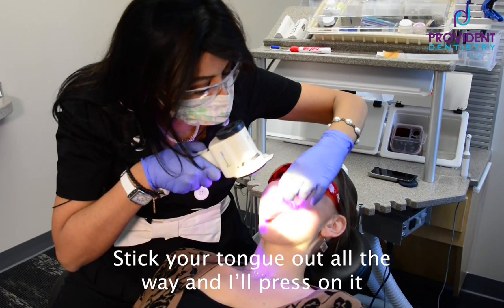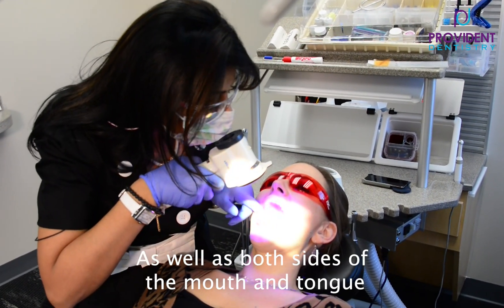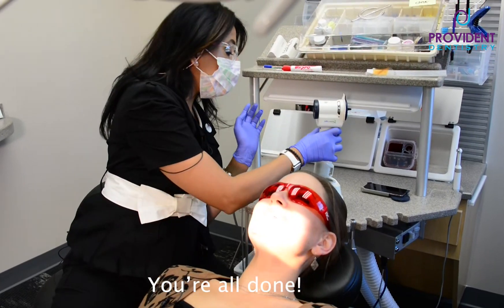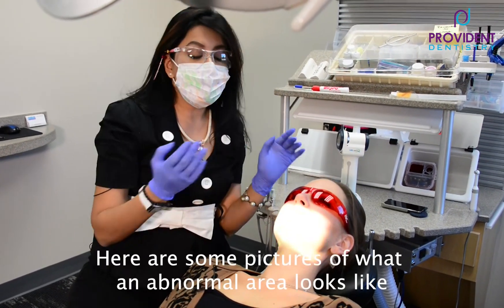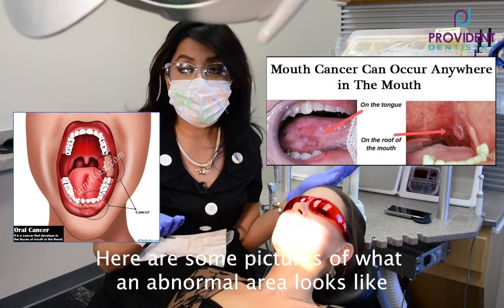Now stick your tongue out all the way — and say ah. Okay, brilliant. Look at the side of your tongue, keep your tongue out. All done — that was easy! So I will definitely show some pictures of what an abnormal area looks like. But that's it — voilà!